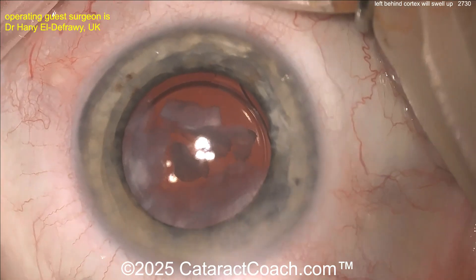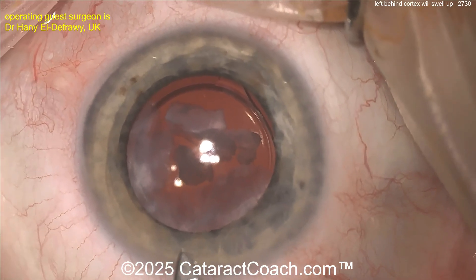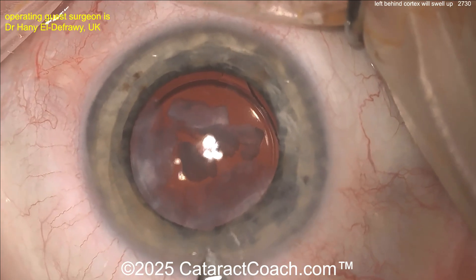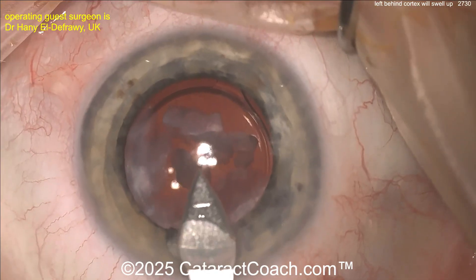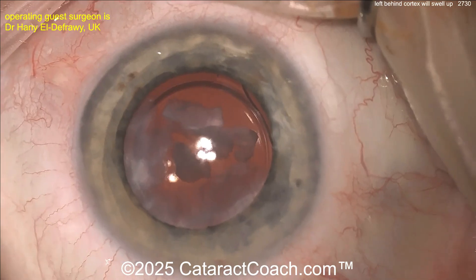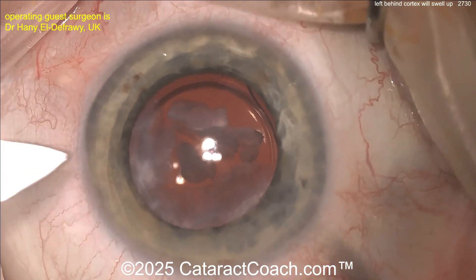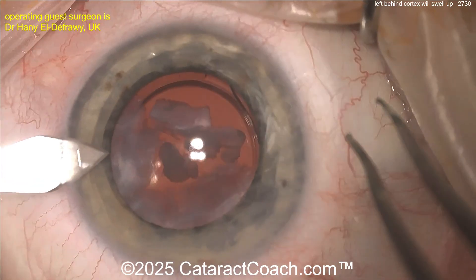By the next morning, if you leave it in the capsule or bag or in the eye, it's swollen up to many times its normal size. Look at that swollen lens cortex — it looks like a lot of lens material right now, but at the time of the cataract surgery it didn't look all that bad. You always have to keep this in mind: remove as much lens cortex as you can. Don't just think it's going to go away in the cascade of inflammation — that's not necessarily the case.